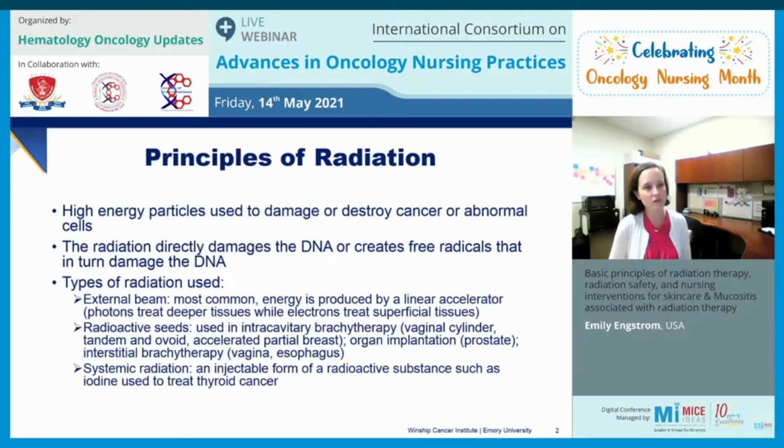We are very fortunate here at Emory to also have proton beam therapy, and protons treat in a whole different way, in that we have less of an exit dose of that radiation. The dose of radiation is delivered directly to the tumor, and then the dose rapidly falls off so it doesn't then exit the body, and create side effects from that.